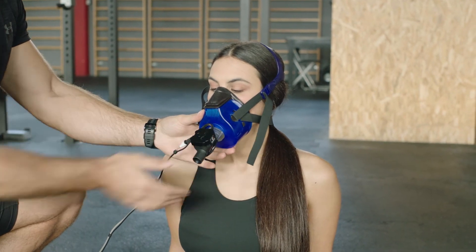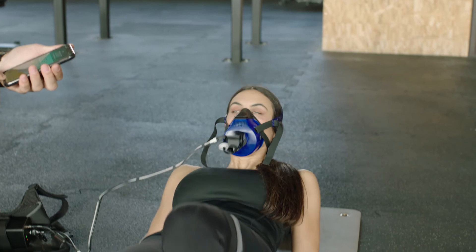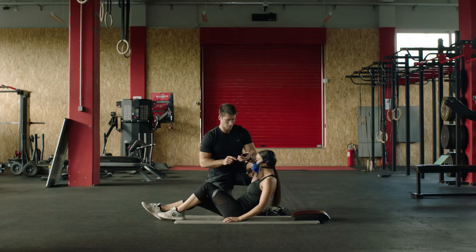If the mask is not tight enough, pull the straps to tighten the mask. If your client exhales strongly enough, there may be some leakage from the mask around the nose.